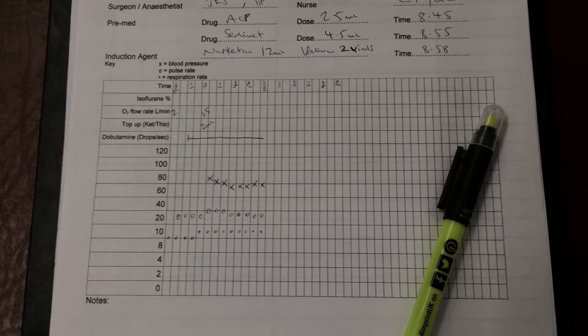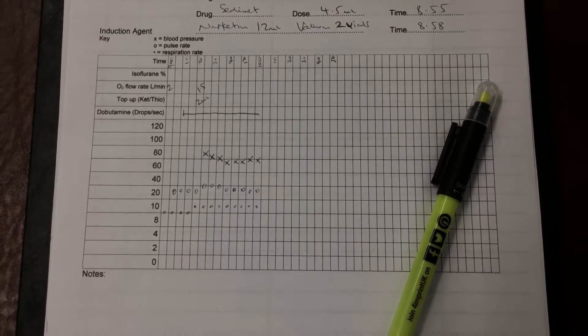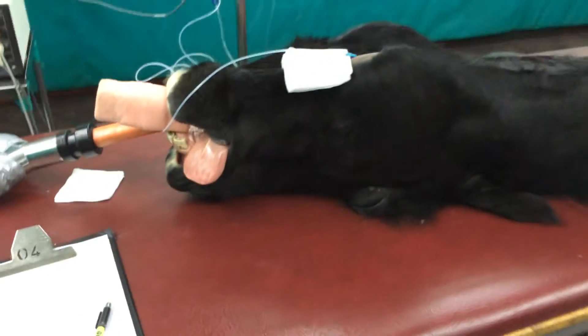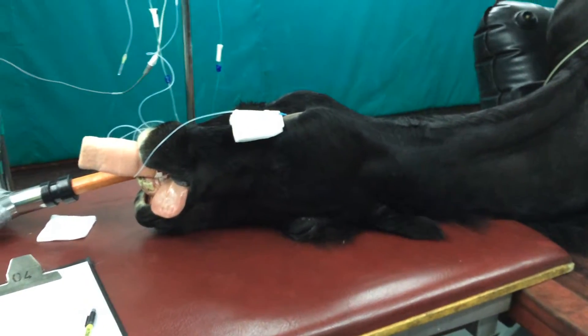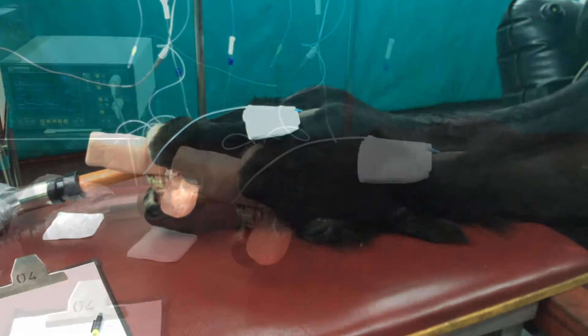Obviously we want to be monitoring the anaesthetic closely, so we have anaesthetic monitoring sheets on which we write down any drugs that we've given and the blood pressure, the respiratory rate, and the heart rate of the horse, so that we can monitor any trends and make sure our horse is okay.